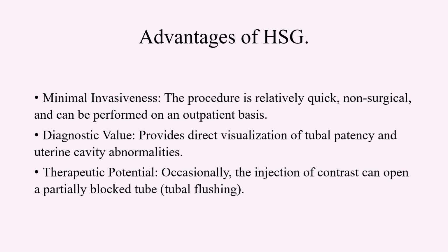Hysterosalpingogram offers the advantage of being minimally invasive. The procedure is relatively quick, non-surgical, does not require anesthesia, and can be performed on an outpatient basis. It provides direct visualization of tubal patency and uterine abnormalities. It may even have a therapeutic potential, as the injection of the contrast can open a partially blocked tube. This is also known as tubal flushing.